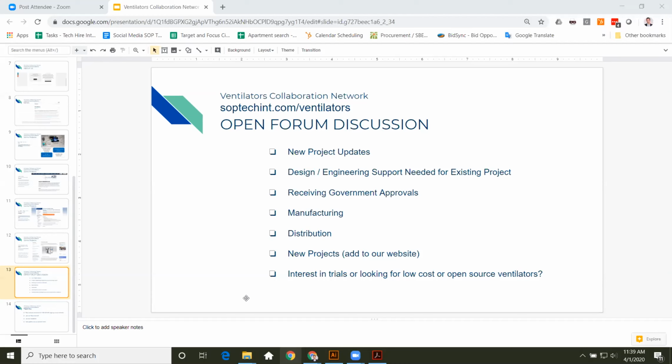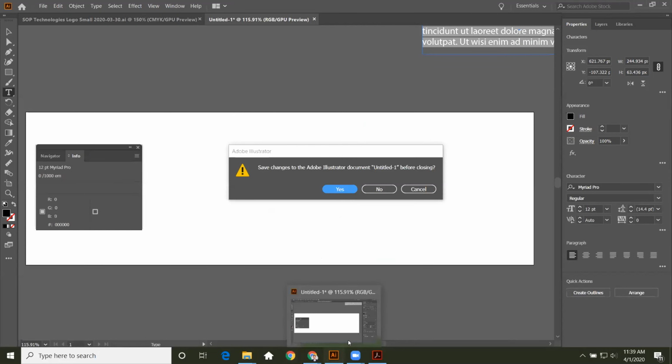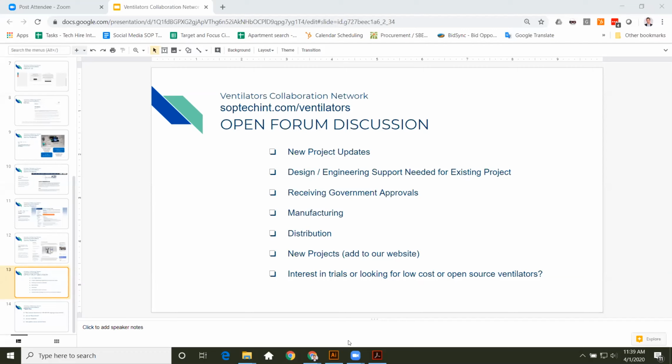Great. Anybody else? Yeah, I would just comment. Most of the designs out there, for those familiar with mechanical designs, are stepper or what they call gear motor, with a Hall effect switch, so that you can control how far the motor moves, which would control the volume and the rate. I haven't seen any that run a continuous one direction motor, although that design would be possible, but you couldn't switch a gear motor in place of a continuous motor.